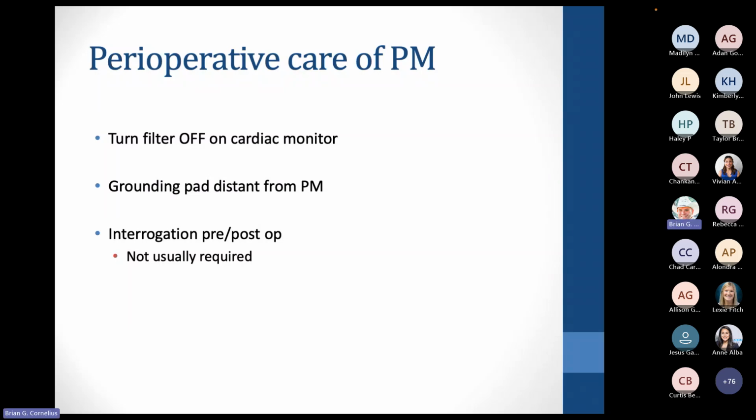From our standpoint, things we need to think about: first of all, there's usually a pacer setting on the cardiac monitor. So you may need to turn that on or off to allow you to see the paced impulses. Just be familiar with the functionality of your monitor. Some do it automatically, some you have to do manually. But like I said, if you look at the monitor and you have what seems like it might be paced, like a clock-regular rhythm of 60, 70, or 80 with a wide QRS complex, just be cautious and make sure that you know if the patient does have a pacer or not.